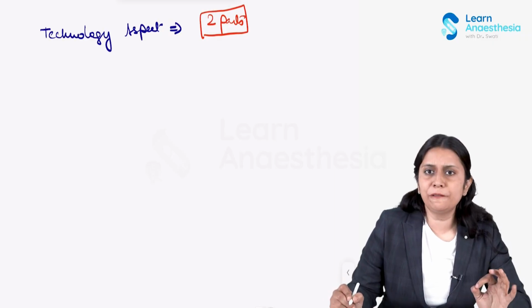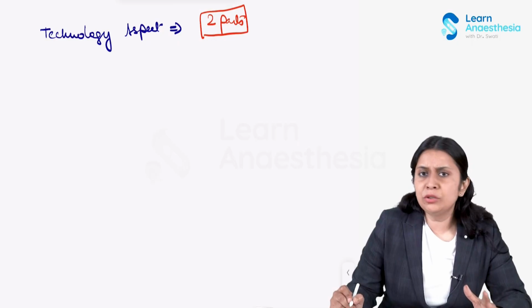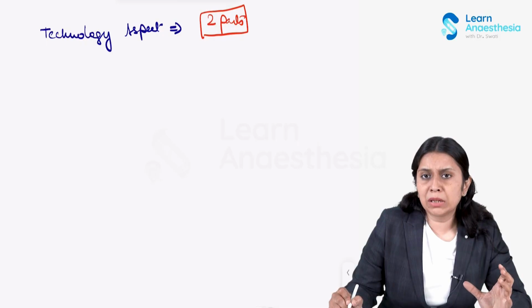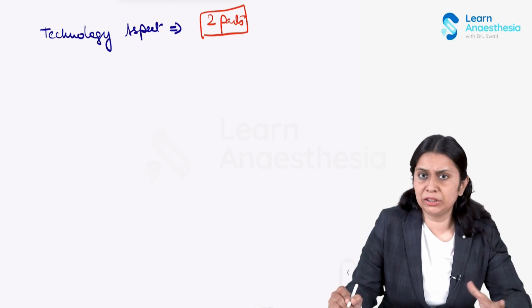The first is a flexible catheter which has two lumens. One lumen is used for aspiration or push of fluids or for pressure monitoring. The other lumen, which is the main lumen, is for giving helium gas, to inflate and deflate the balloon attached to that lumen.